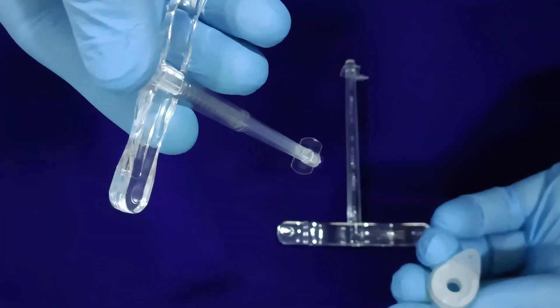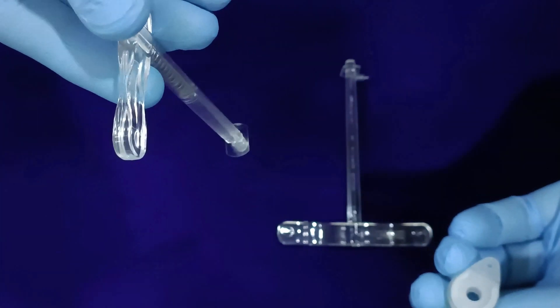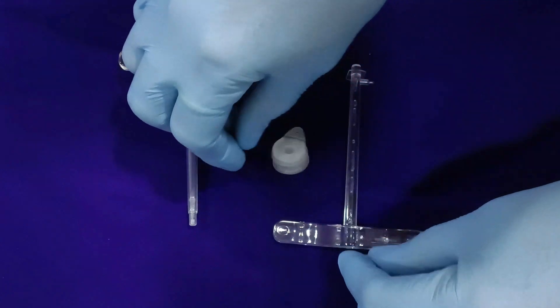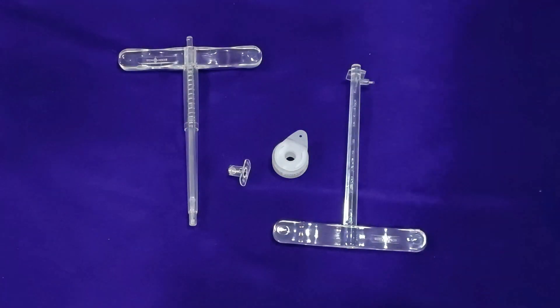That's a fairly simple mechanism to ensure smooth insertion and the role of the voice prosthesis. Enjoy the innovative solutions from the pioneers in Otorhinolaryngology here on Meditech.